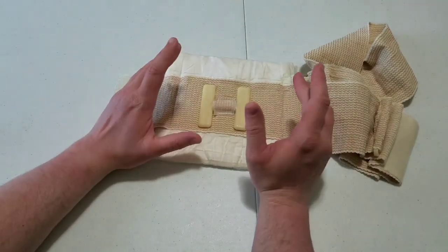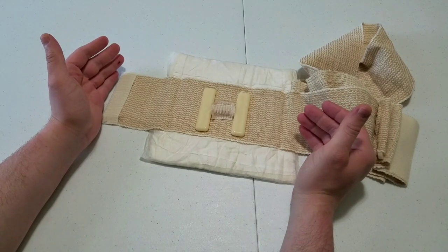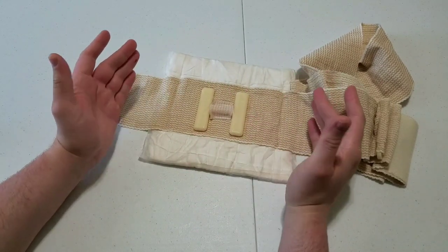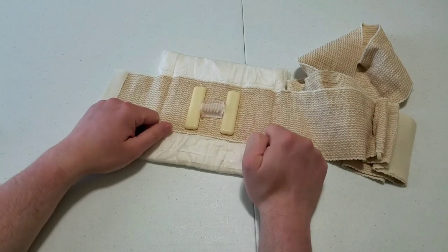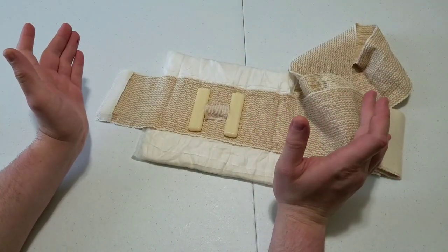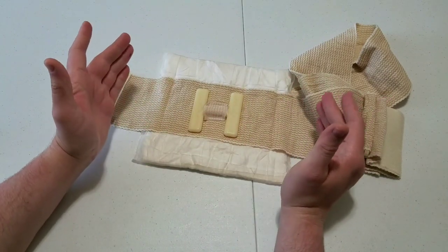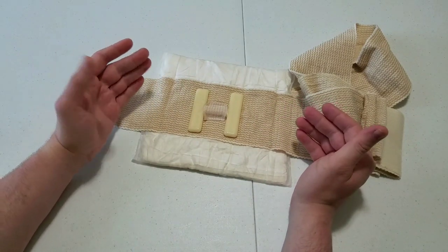My biggest beef with it is that this thing has made its way into a lot of public access hemorrhage control kits — schools, libraries, places like that where it's expected to be used by a lay member of the general public during an active violence incident. I cannot see some teacher at a school during an active shooter getting this to put on an injured student and being able to use it. I have handled these things multiple times in multiple classes; this one has probably been wrapped up and refolded and used over a hundred times. I've got experience using this thing and it's still difficult for me to use on myself one-handed.